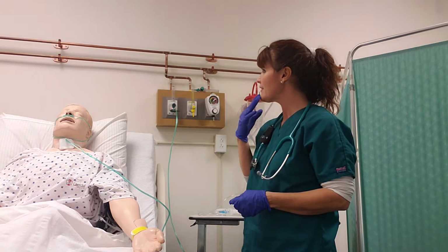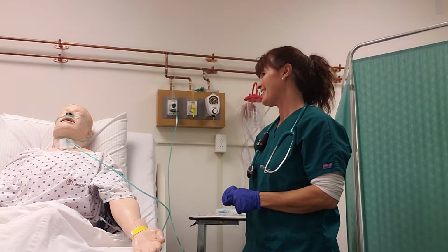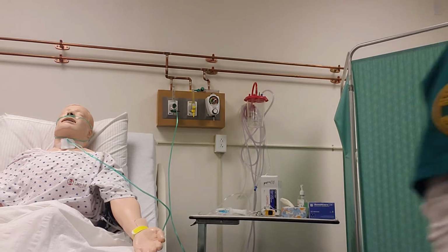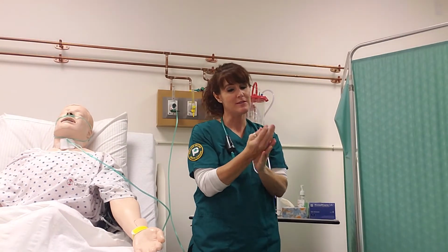All right, just breathe regularly. And for right now, try to breathe just mostly through your nose. Let's get your oxygen up. No mouth breathing. Okay, we'll see you shortly. And you would also want to get rid of your gloves and sanitize your hands again. We don't want to spread infection.